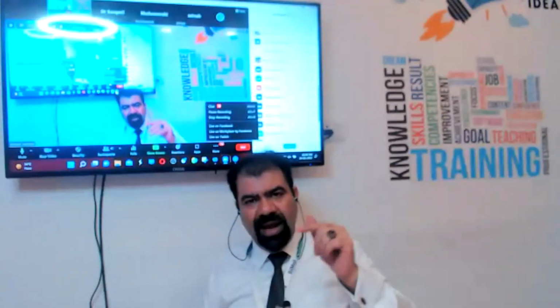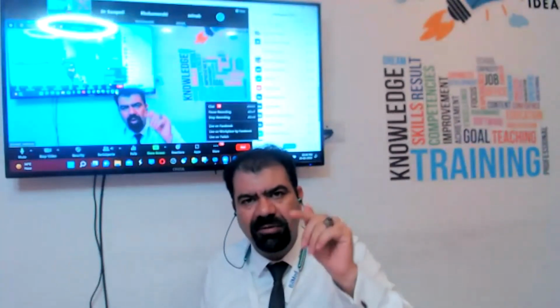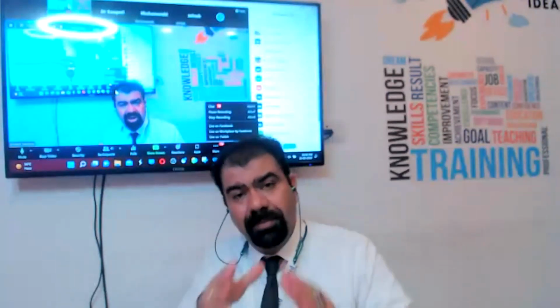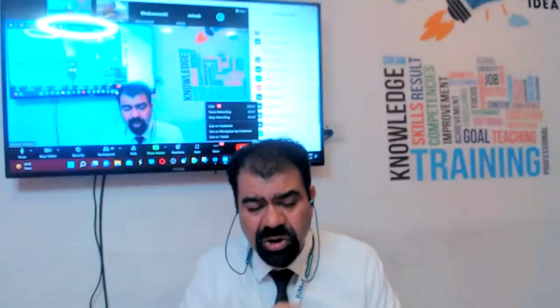So the endometrium has to be as thin as maybe 4 or 5 millimeters. If there is 10 millimeters or more, there is something in the endometrium which is not picked up by your machine, but the endometrium is telling you, doctor, I am having something in me, that is why I am more bulky. Now, how to differentiate whether I am dealing with a blood clot in that endometrium or an RPOC? Second part of the question.